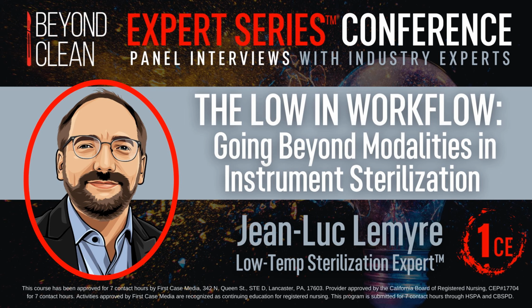Yeah. I would point everybody to consult your IFU for that sterilant cup and how to handle it, because I'm sure if they're marketing it as such, they're going to have something to do in that situation if it does get ejected. Absolutely. Yeah. So let's wrap up this conversation by talking a little bit about ozone. I suspect that the majority of our listeners don't have a significant amount of experience with it. So can you tell us, what's useful about ozone in the low temp sterilization discussion, and why you think it's important?